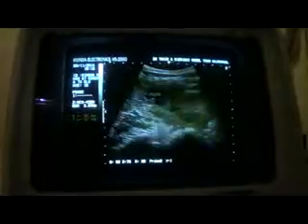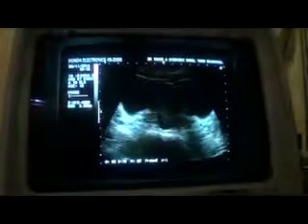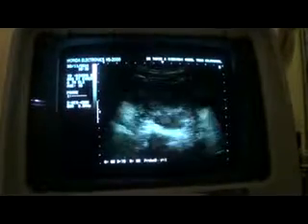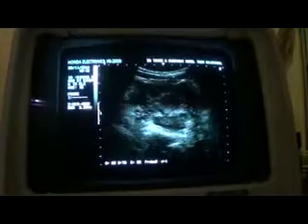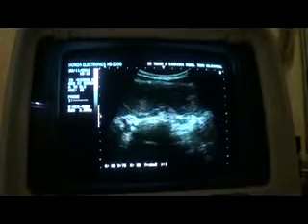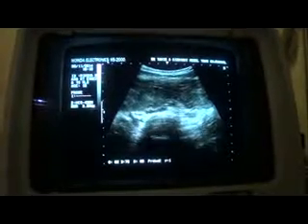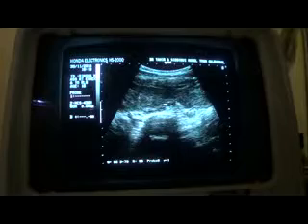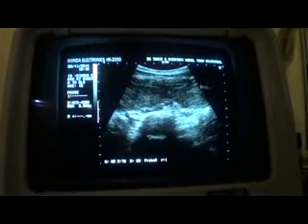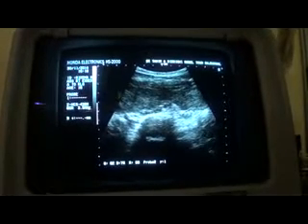And here, again I want to show you this. This is the urinary bladder. As I move upwards, you will come across the uterus. As I move upwards, you will see the mass. This is the mass, and you can see it is dumbbell shaped, giving an appearance of a dumbbell extending towards the left side in the suprapubic region, and then extending towards the right side.